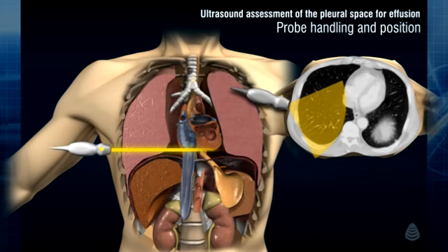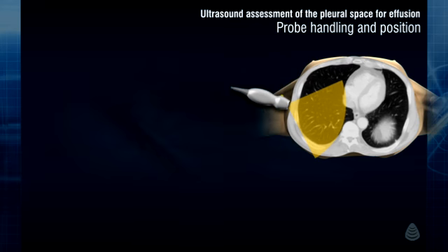As previously mentioned, assessment of the pleural space in the transverse plane is not optimal, as it does not provide adequate information about the relative position of the surrounding organs. Let's illustrate this point with an example.